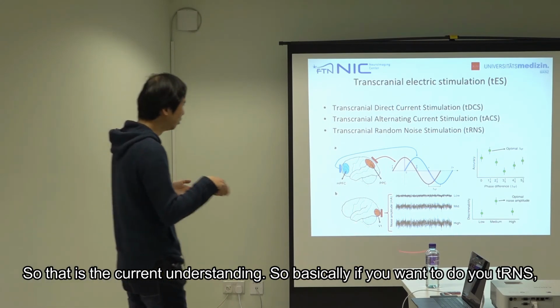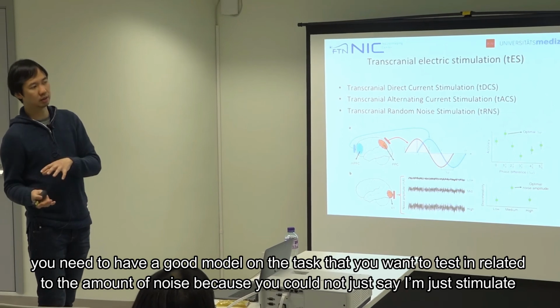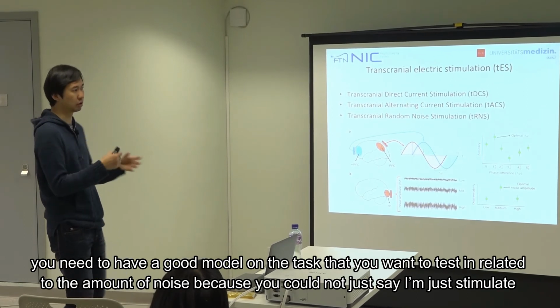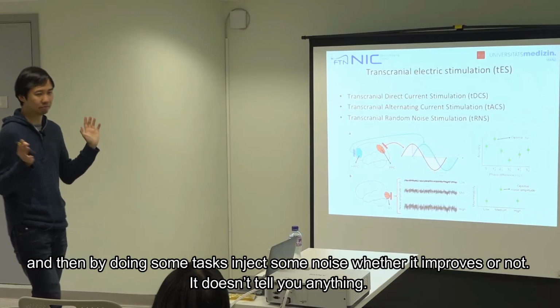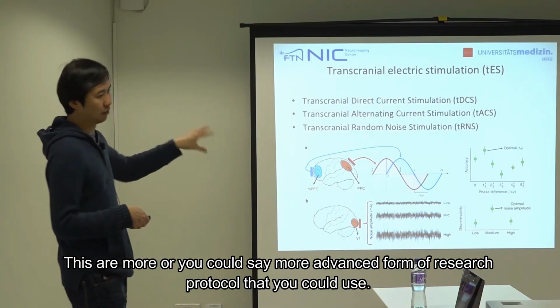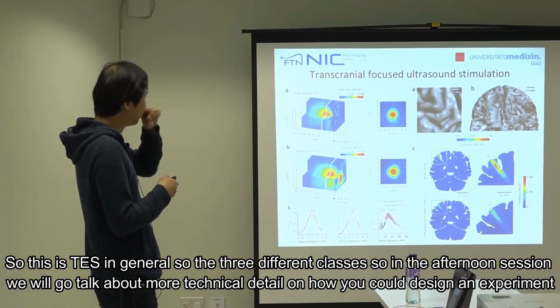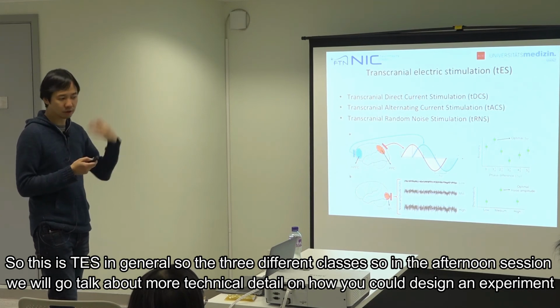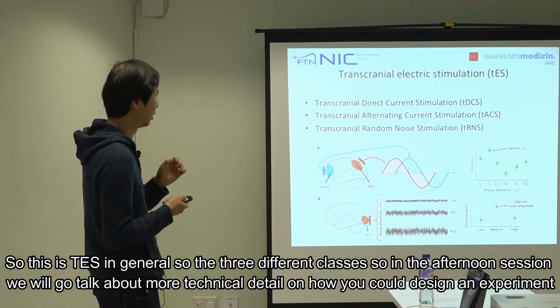So basically, if you want to do tRNS, you need to have a good model of the task that you want to test in relation to the amount of noise, because you could not just say, okay, I just stimulate and then by doing some tasks, inject some noise, whether it improves or not, it doesn't tell you anything, okay? So these are, you could say, a more advanced form of research protocol that you could use. Okay, so this is TES in general, the 3 different big classes. So in the afternoon session, we will talk more about the technical details on how you could design an experiment.